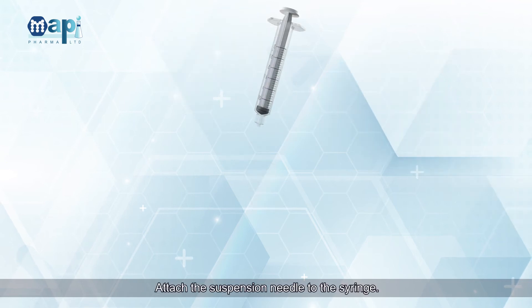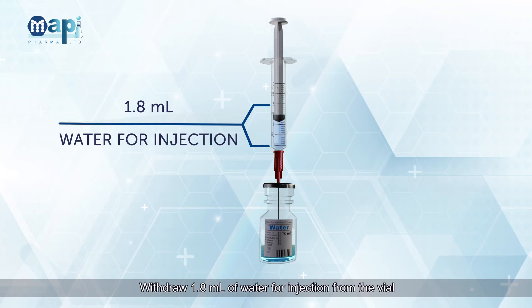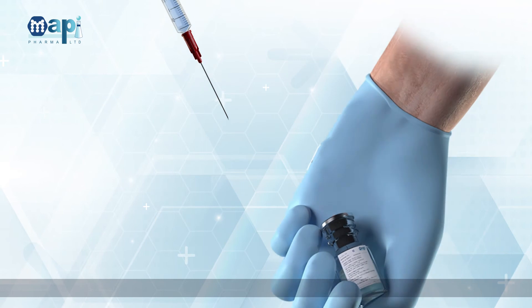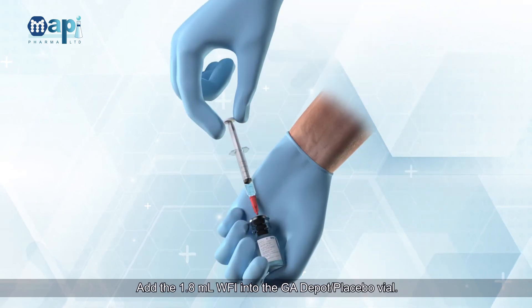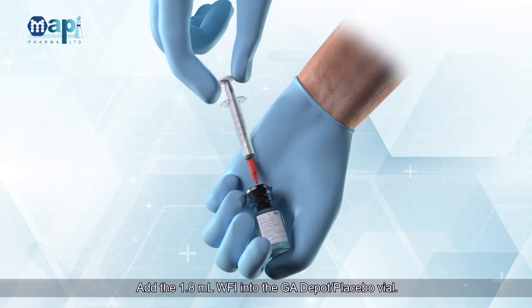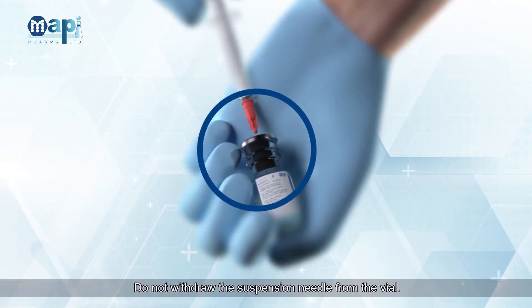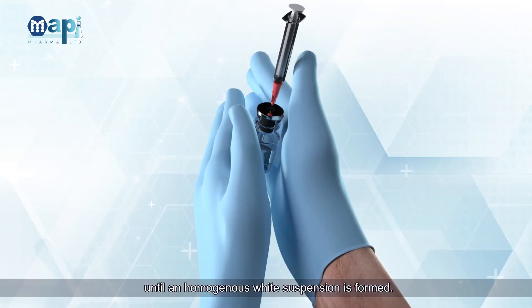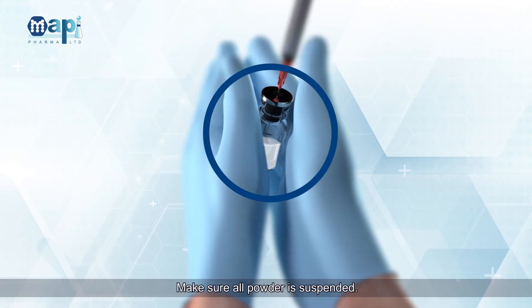Attach the suspension needle to the syringe. Withdraw 1.8 milliliters of Water for Injection from the vial with the syringe. Add the 1.8ml WFI into the GA Depot or GA Depot Placebo Vial. Do not withdraw the suspension needle from the vial. Gently rotate the vial between your hands until a homogenous white suspension is formed.